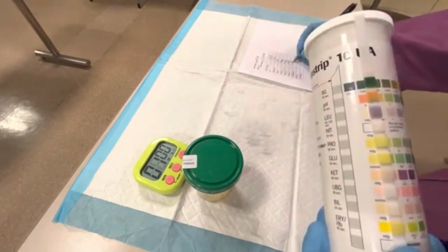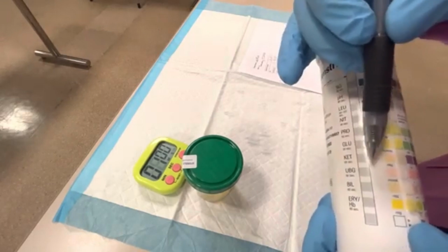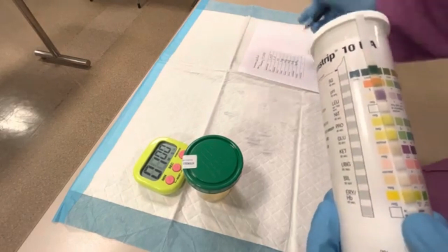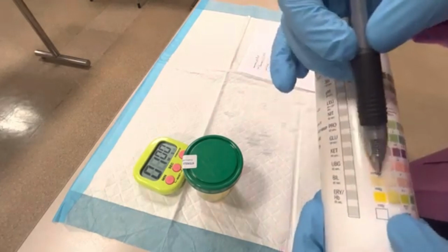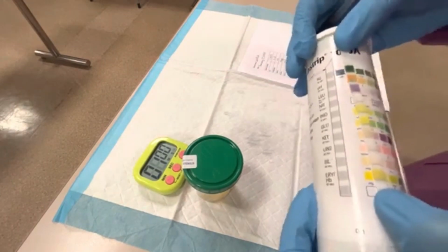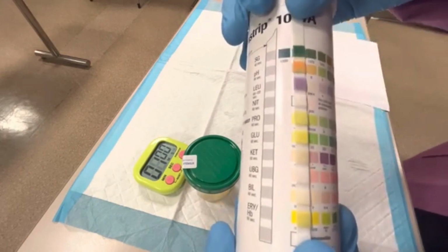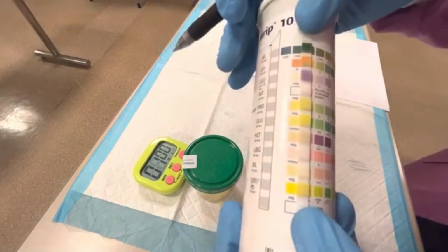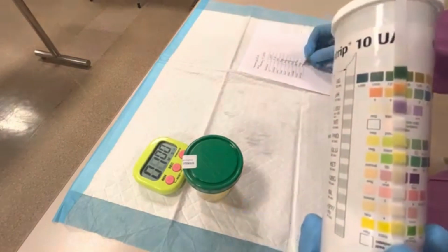That's good. And then our urobilinogen result, that is a normal reading. All right, two more here. Bilirubin, so I'm going to be comparing these to this pad. This is definitely a negative result. And then erythrocytes, so these are red blood cells. Hopefully you could see, it's kind of hard to see on this. It is not a negative result. There's a little bit of green dots in it. So that is comparable to trace, which is right here. So I'm going to write trace.